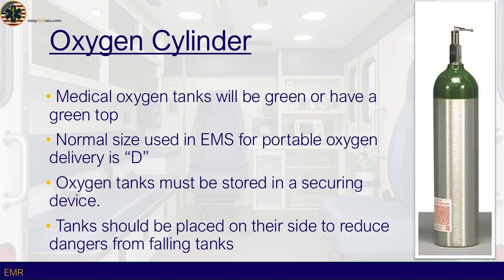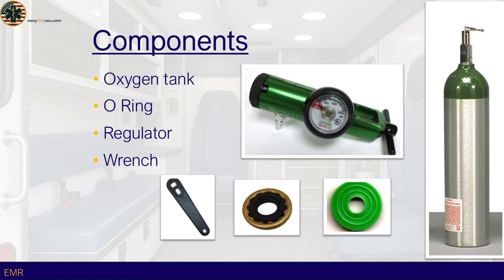Connecting a regulator to an oxygen tank is a fundamental EMS skill that ensures a controlled and safe oxygen supply. First, confirm that the tank is green and properly labeled for medical oxygen. Before attaching the regulator, quickly crack the tank open by turning the valve slightly and then closing it. This clears any dust or debris.